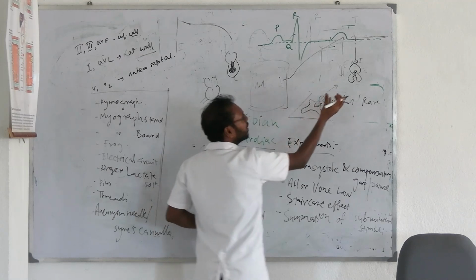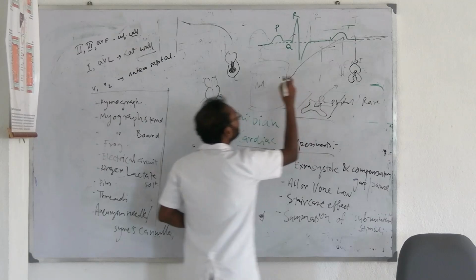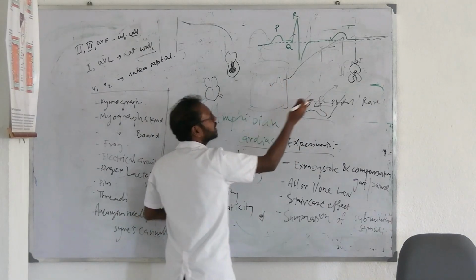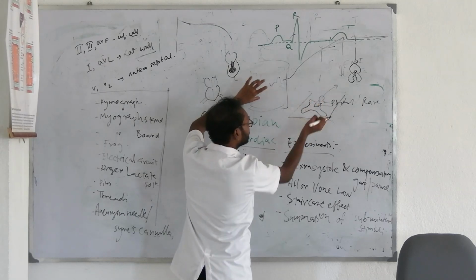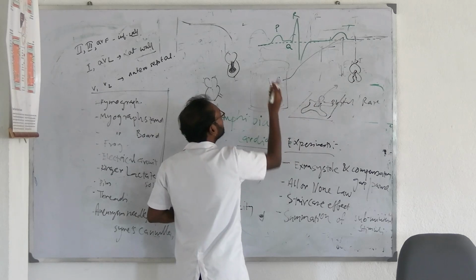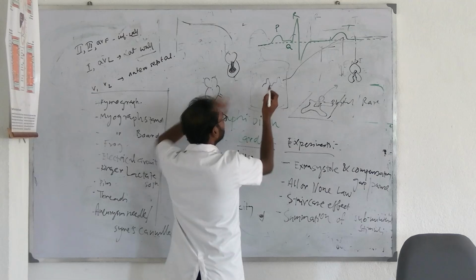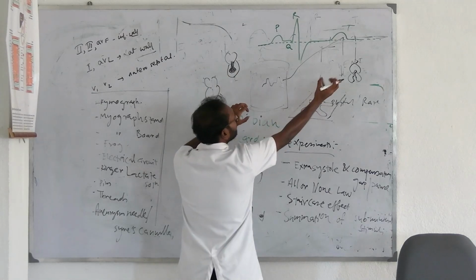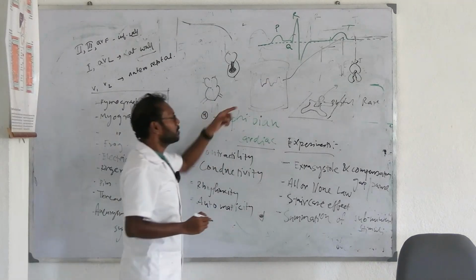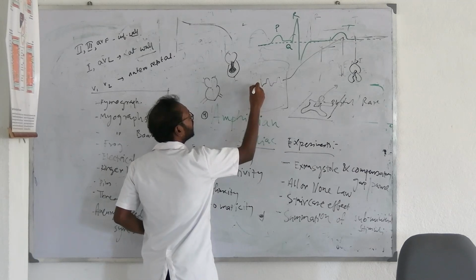Okay, now again contracting, that is systole. Now when there is diastole, relaxing, when it is relaxing this comes down like this, then again it is contracting. This side of the pin comes down and this goes up, so again it will go up. Then again diastole happens, it's releasing again, and it keeps happening like this. Then again it's contracting, whenever it's contracting this pin is going downwards and it is going upwards, so again it will go upwards. Okay, so this is how it keeps happening. Now again it will be dilating, it comes down like this.